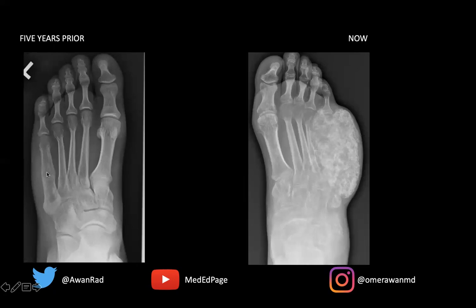We have soft tissue swelling right here. So this definitely has aggressive features. And then five years later, you can see marked expansion of this lesion. There is some whittling of the fourth metatarsal shaft, soft tissue swelling. The tumor has resulted in chondroid matrix mineralization in the form of rings and arcs — you can see these stippled areas, these comma-shaped areas of increased density.